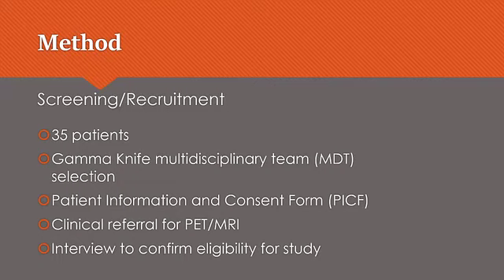On the day of the FET PET MRI, the patient would arrive to the department where the research nuclear medicine technologist would interview the patient to confirm eligibility, to cannulate, and to complete an MRI safety questionnaire. The technologist would then run through the procedure and complete any final preparations.